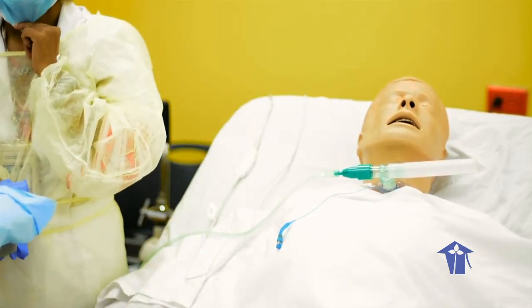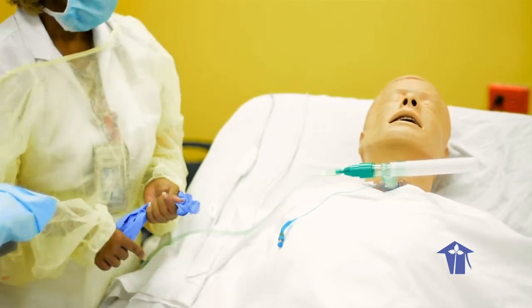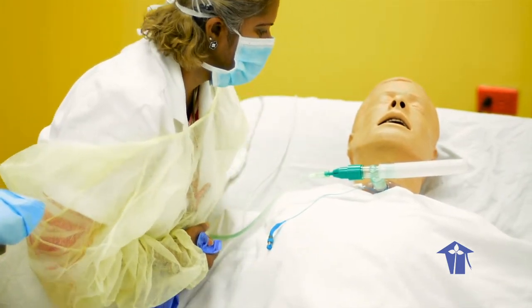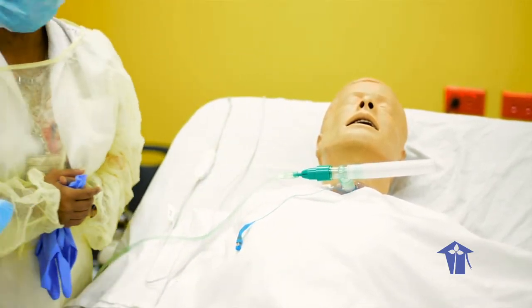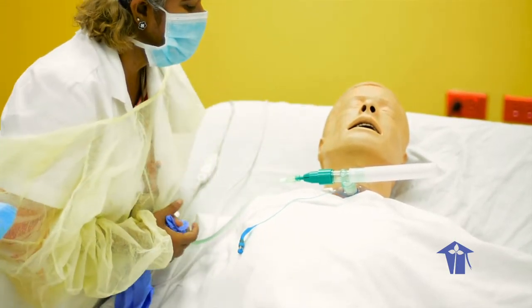Determine the need for tracheostomy care. Assess patient's pain and administer pain medication if indicated. All right, I'm having a look at your tracheostomy and I see that it is a little bit untidy. I looked at your notes and it has not been cleaned since yesterday, and there's some sputum observed on the dressing. So we will clean that for you, right?